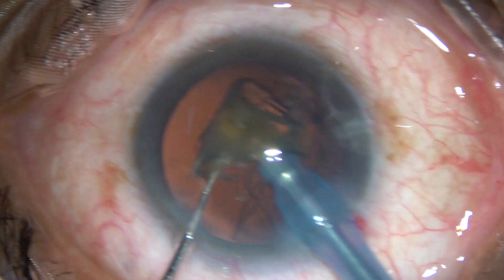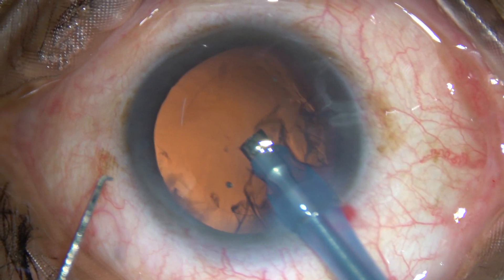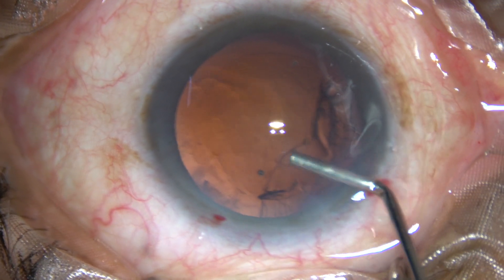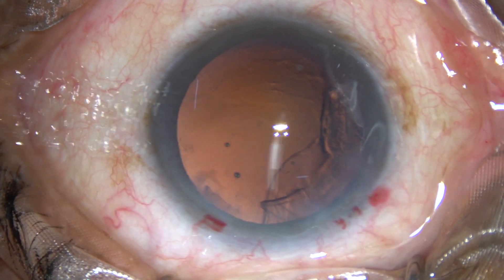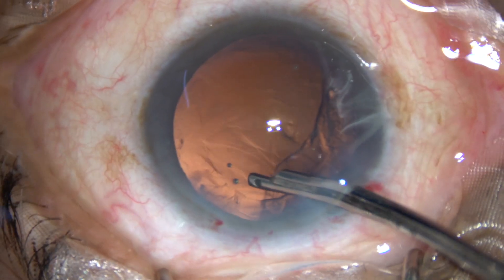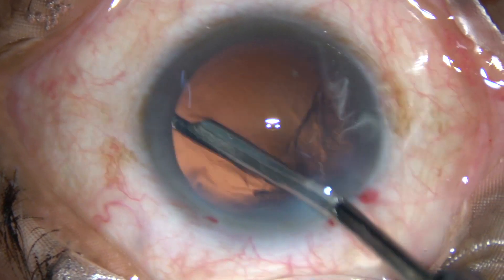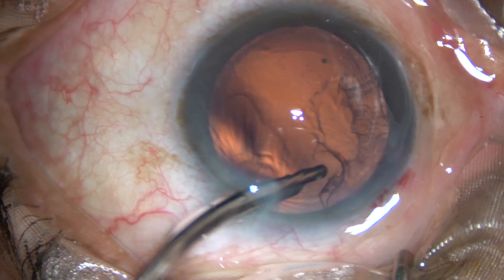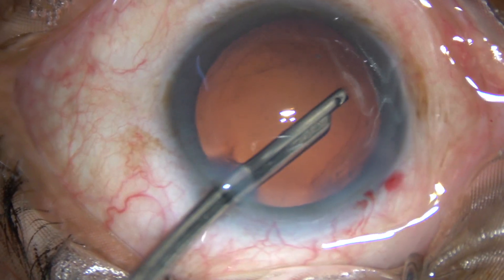We are almost through — the cortex has also come along with the nucleus and very little cortical matter remains in the supernasal aspect. A little bit of viscoelastic is injected. Since there is only one side port, I have decided to use this very simple instrument — a Simcoe cannula, 23-gauge — and very comfortably you can remove the cortical matter with this instrument. Cortex is removed.